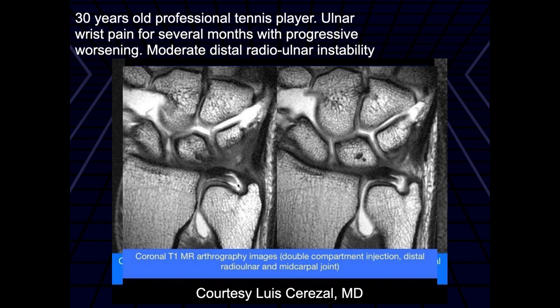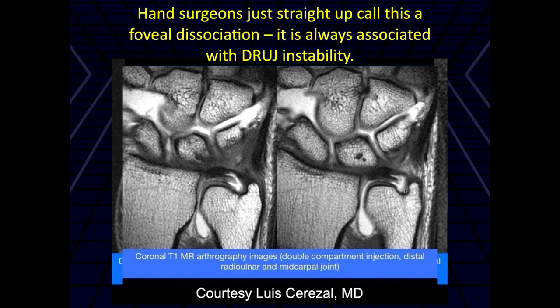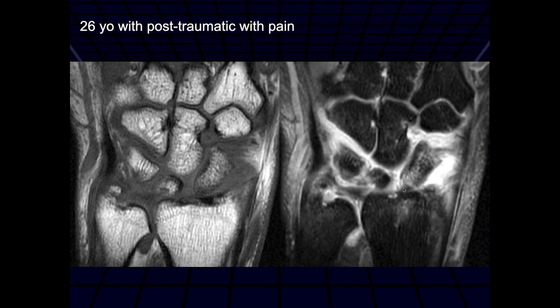Here again, you can see the upper laminar tear right through here. So here we have a 26-year-old with post-traumatic pain, and we can see a remote-appearing ulnar styloid avulsion fracture. It looks like the lower laminal attachments attach to that ulnar styloid avulsion fragment.